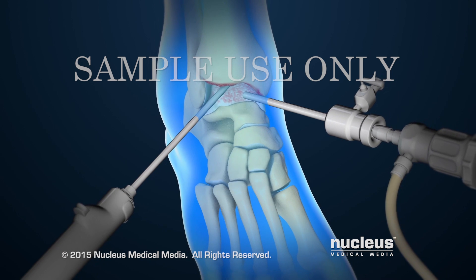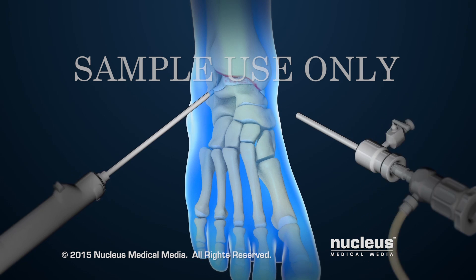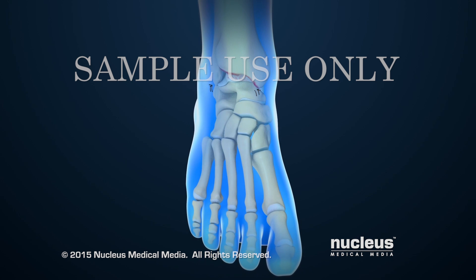Once the treatment is finished, the sterile saline will be drained out of the joint. The instruments will be removed and the incisions will be closed with stitches.